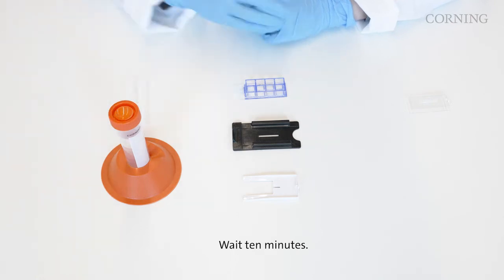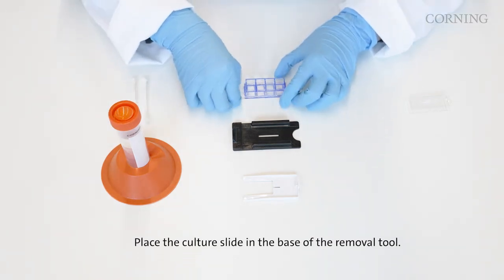Wait 10 minutes. Then place the culture slide in the base of the removal tool.